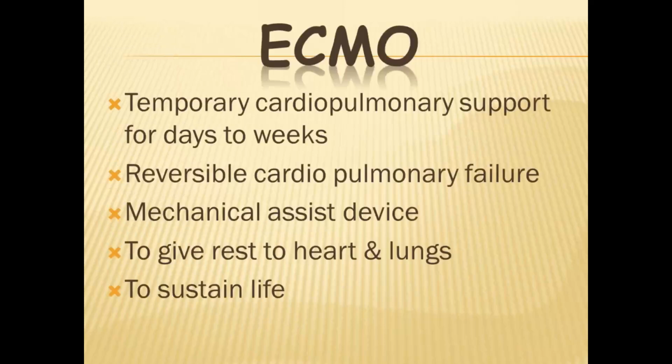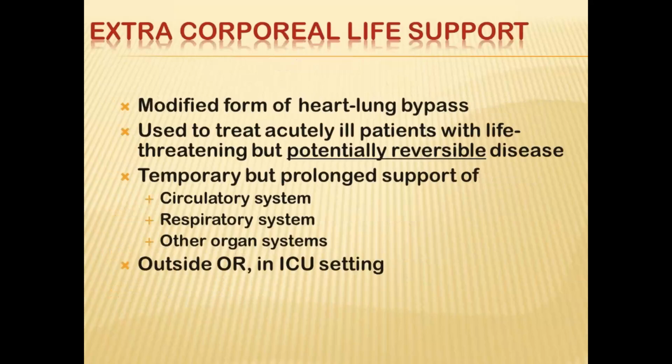So ECMO is a temporary cardiopulmonary support that can be extended for a number of days to weeks. It is basically for a reversible cardiopulmonary failure. It's like a mechanical assist device. The most important intention is to give rest to the heart and lungs and to sustain the life till the time the heart recovers. It's basically a modified form of heart-lung bypass used to treat acutely ill patients. Temporary but prolonged support for the cardiorespiratory system and for other organs.